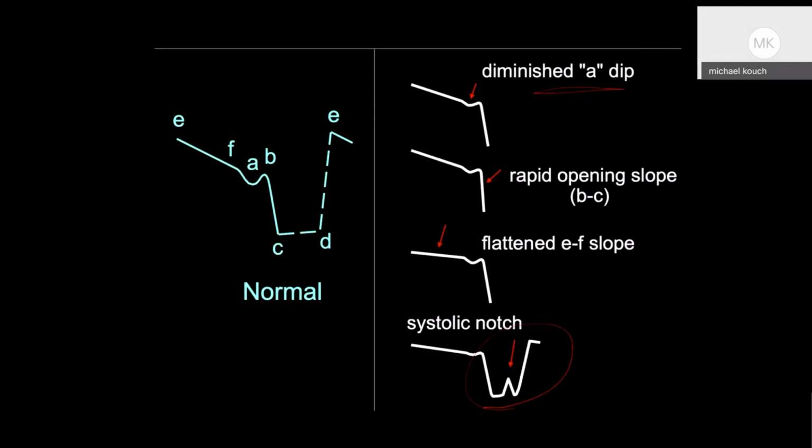Which view are you using to put M mode through the pulmonic valve? Are you using a parasternal short? So you take a parasternal short axis view, right, and then you fan it upward. So a parasternal short axis view looks like this, right? With our papillary muscles, we fan upwards, and we start to see our valve leaflets, right? Then we keep going, and we see our Mercedes-Benz sign here, right?